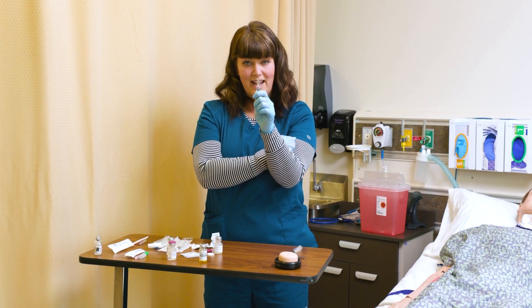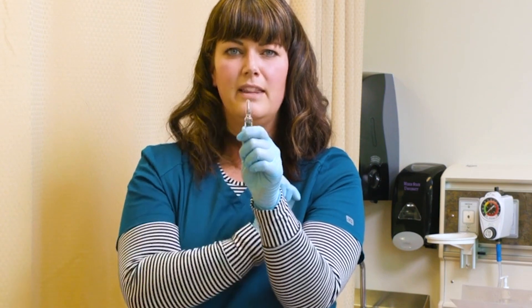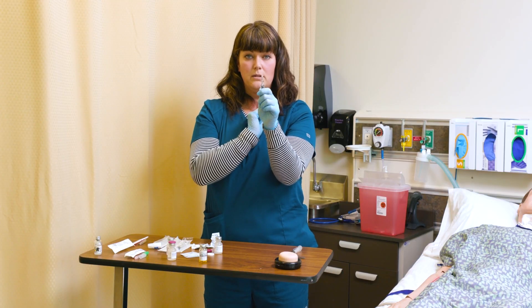They do have ampoule breakers now. There are several different styles, but what they do is they drop on from the top and cover that neck, so when you snap it off, you're not exposed to that broken glass.